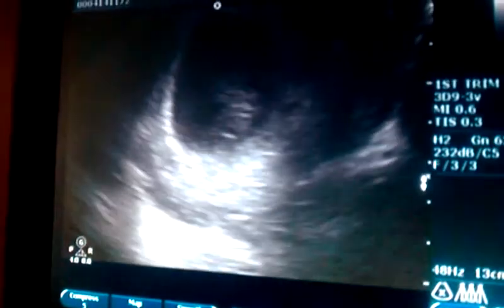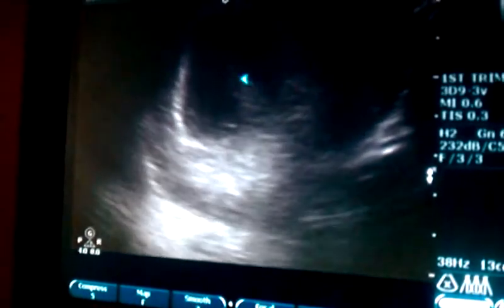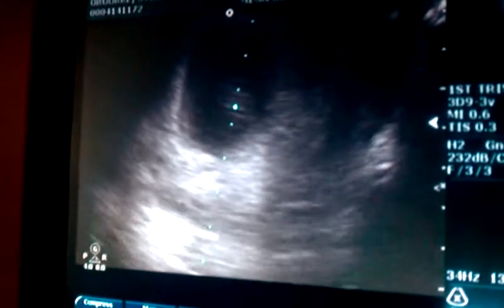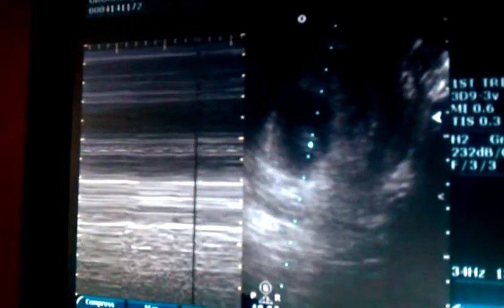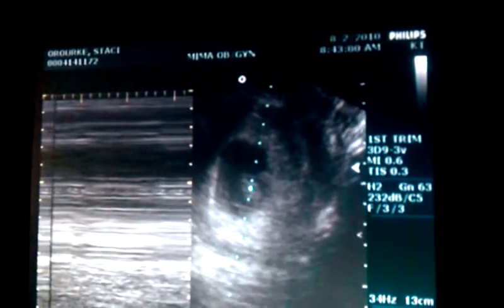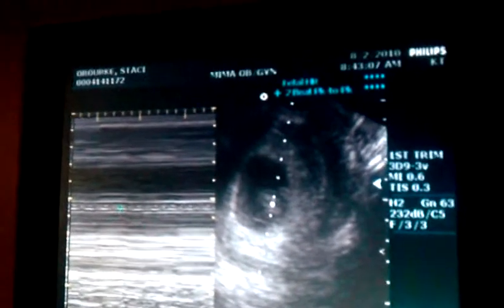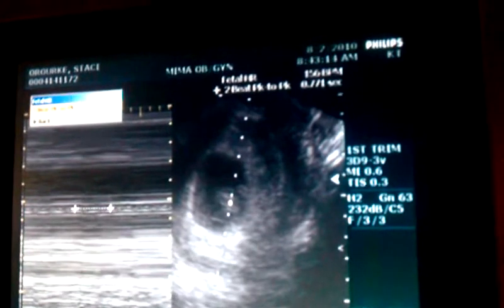There's the heart. It's really easy — I'm doing an EKG. I ain't moving my hand, so I did it to show that those slips are coming off. Baby looks beautiful, beautiful. I can't even move that one little bit — there's the best one. 156 — perfect. I like a good challenge first thing in the morning.